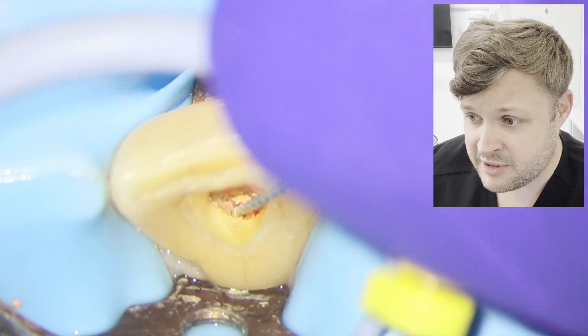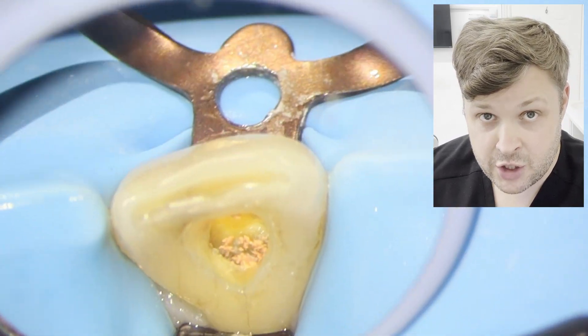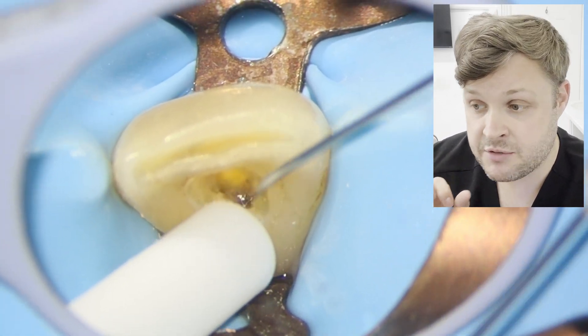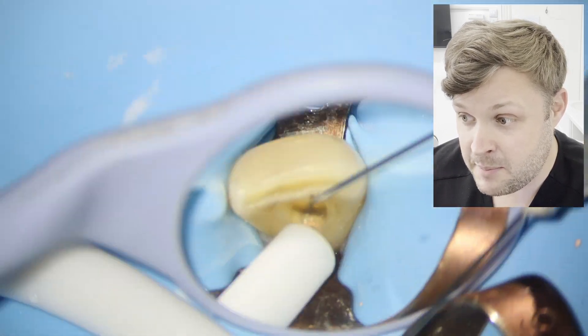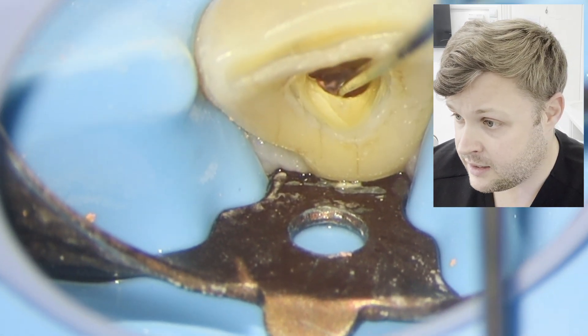I'm using different sized H files — 25s, 20s, and every now and then a 15. You've got to be careful with the 15 because it's quite small and the screwing action can cause it to fracture, although I'm yet to have a fracture with an H file during GP removal. Sometimes it just takes time and patience — just very gently pick away at the GP.